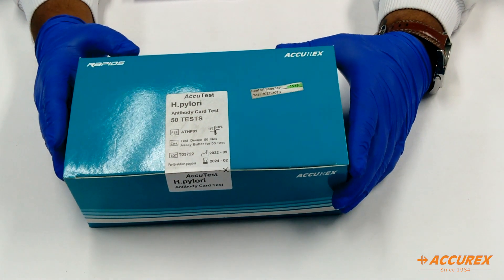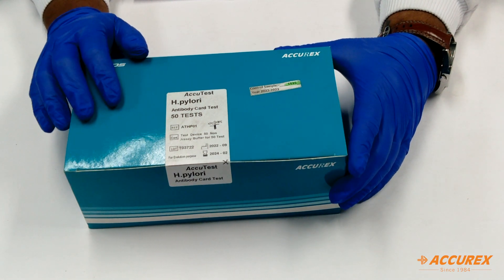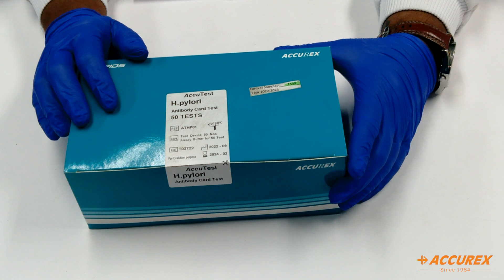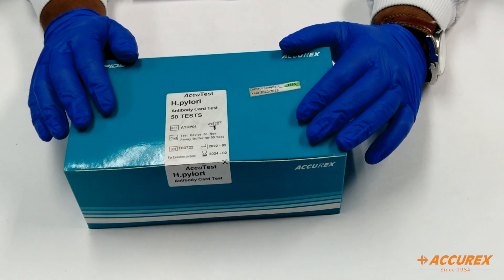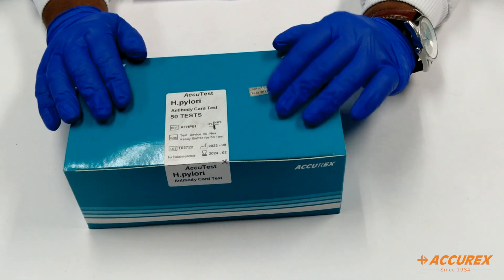Hello friends, welcome to AcroX YouTube channel. Today we have brought a product called H. Pylori, also called Helicobacter Pylori, in serum or plasma or whole blood. The method used is chromatographic immunoassay detection for IgG, IgM, and IgA inside the human sample.